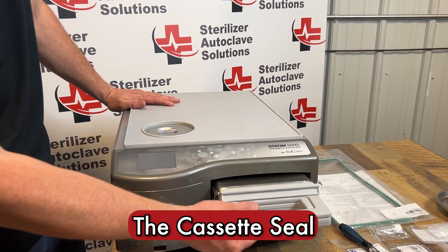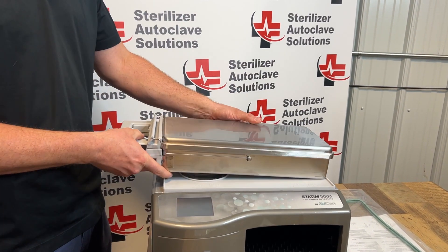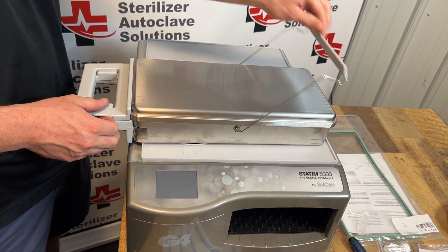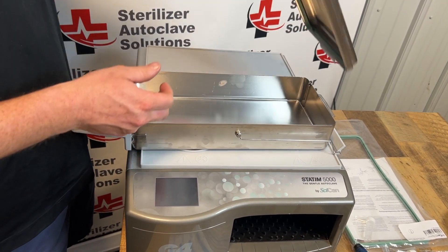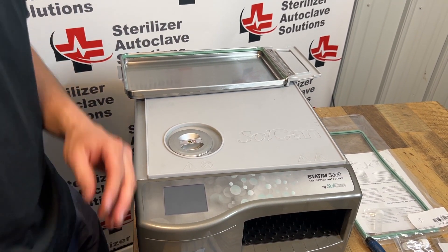First thing we're going to start with is the cassette seal. We're going to remove this cassette. I am placing it on top of the unit — I have a STAT mat so I'm not going to scratch the paint. I'm going to separate the top from the bottom, setting the bottom off to the side.